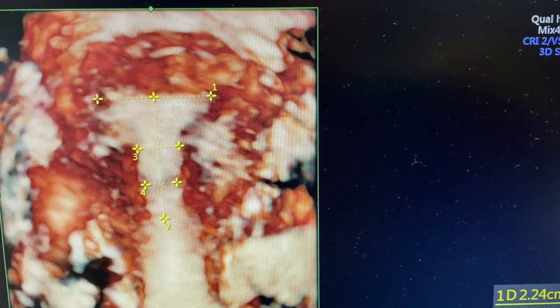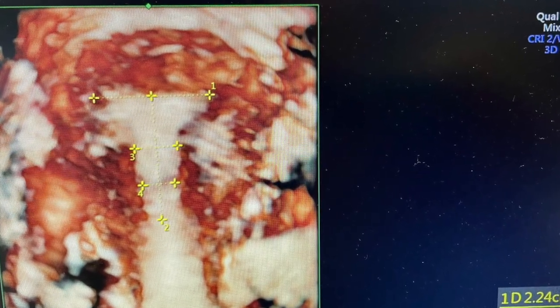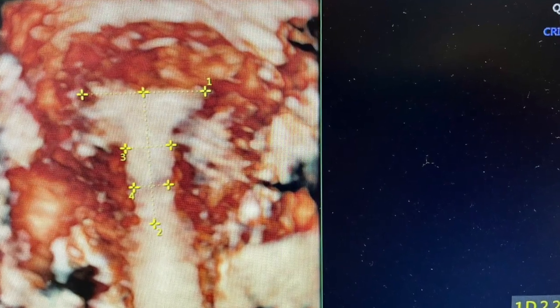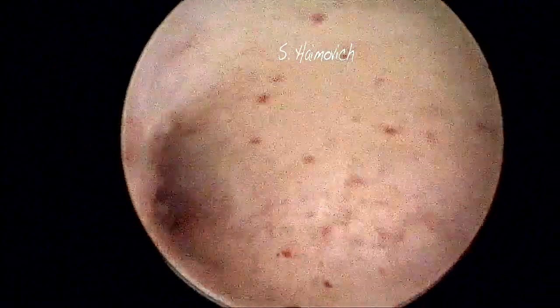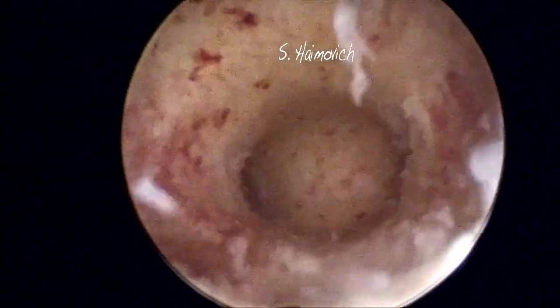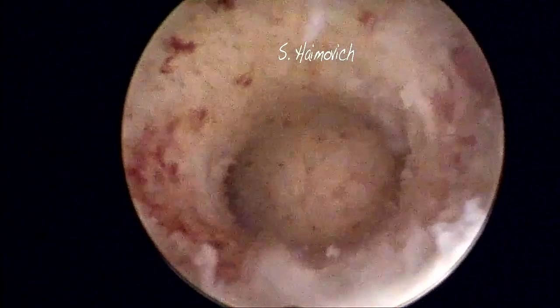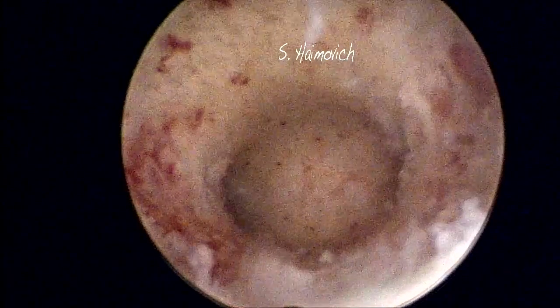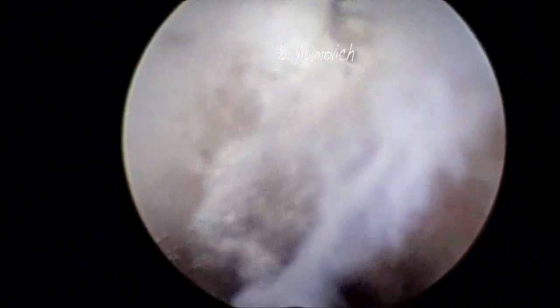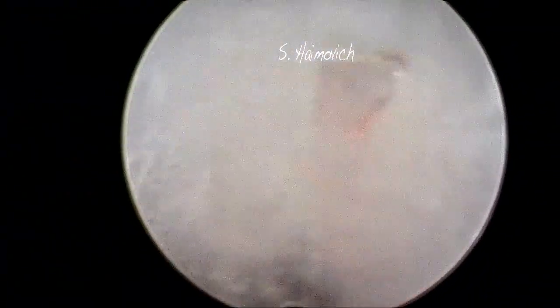The patient had more than five years of infertility and treatments. During 3D ultrasound it was identified as a mild T-shaped uterus. You can see here the narrow cavity — tubal ostiums are not visible from the internal os.